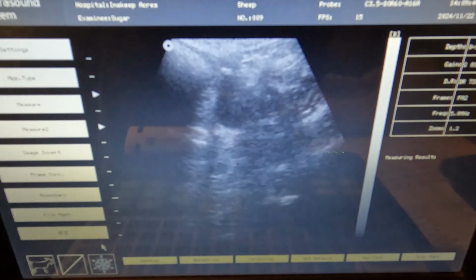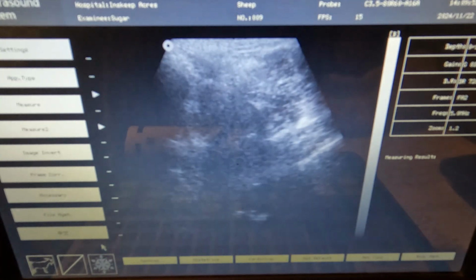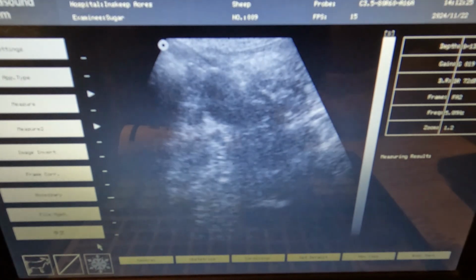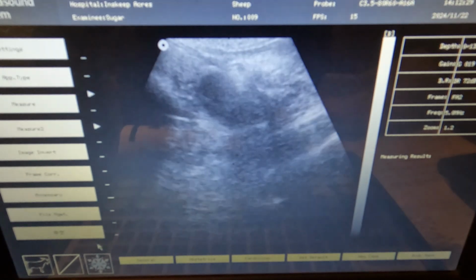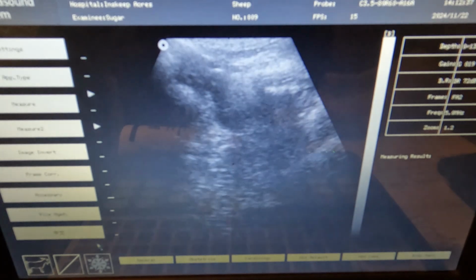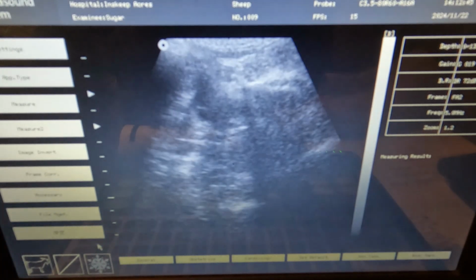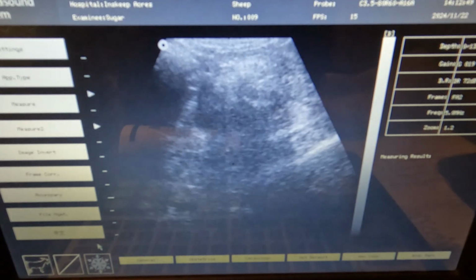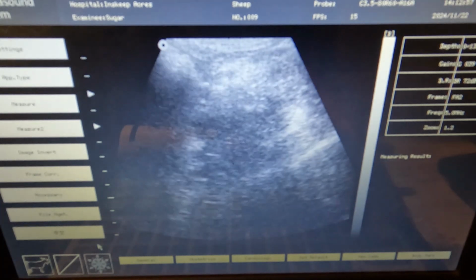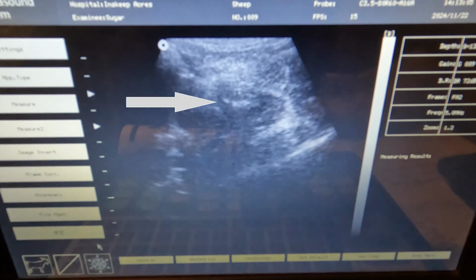And she's not standing still. She's run out of grain. Still a little blurry, but I think there's 4 sacs there. There's a baby there. Okay, there's 1 in the top right. Put your leg down, right. That goes blurry. So there's one right there for sure.